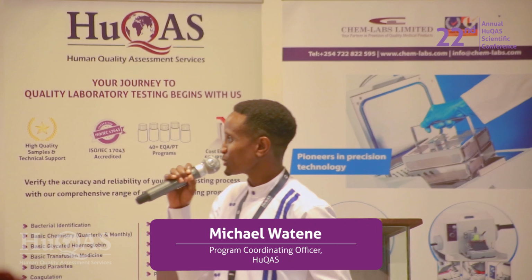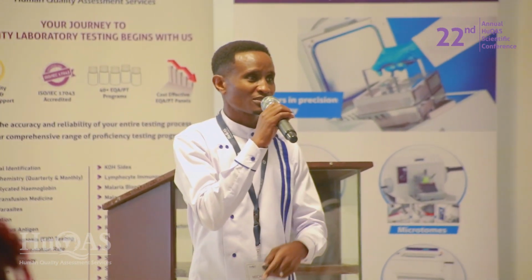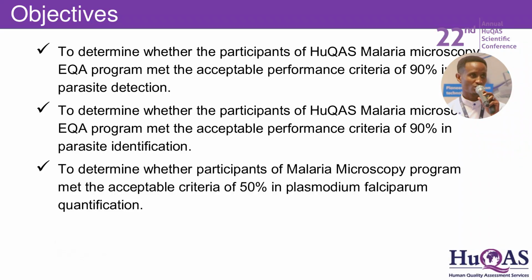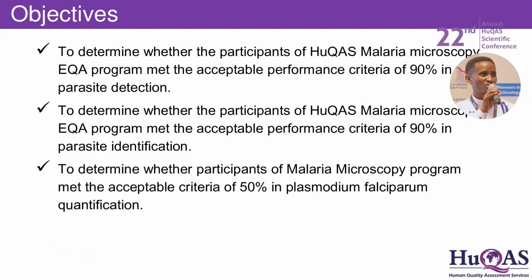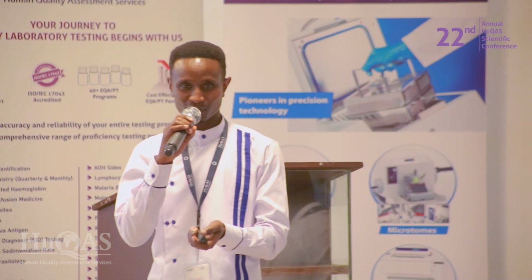Kindly allow me to bring to you science again. This is about malaria microscopy. So this presentation, the objectives are three. We want to determine whether during this time between 2020 and 2022, our participants were able to satisfy the requirements of detection, species identification, and quantification. There's one aspect which we do here, which is species stage identification, which I will not tackle. So that is what our objectives are today.